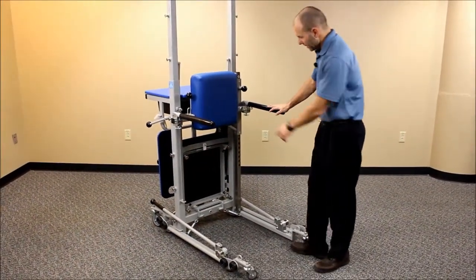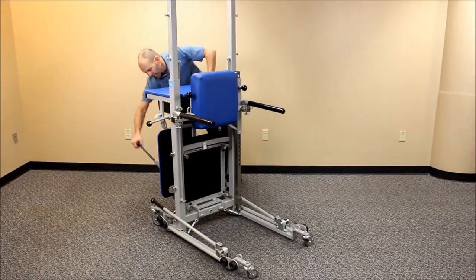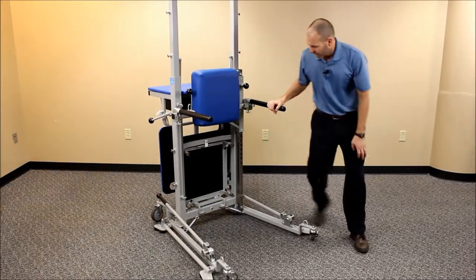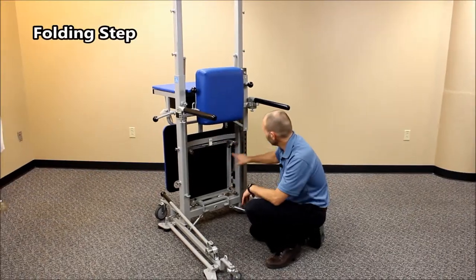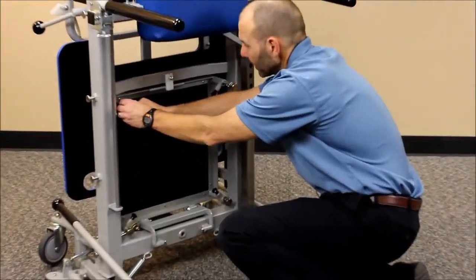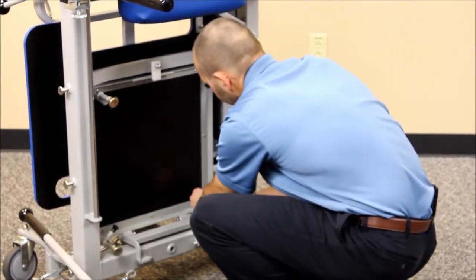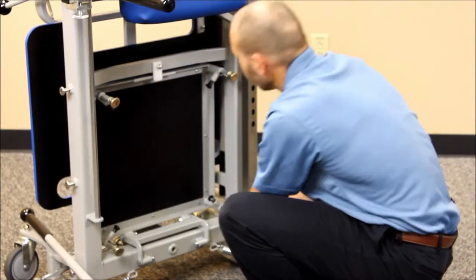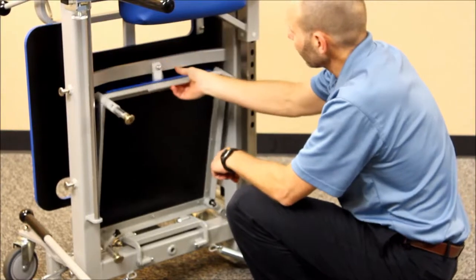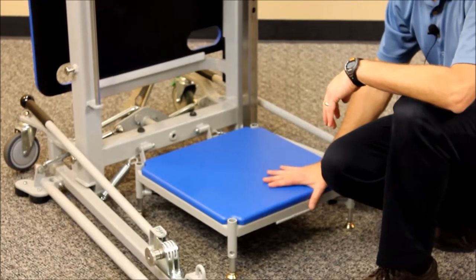On this side of the unit there is an actual step — I'll go ahead and lower the stabilizing bars and lock this into position before showing you. The step is folded up inside the unit and is adjustable. You adjust it by pulling out the black knobs and adjusting in two-inch increments, anywhere from four to eight inches. We're currently in the six-inch position. Move the plastic lock out of the way and this step just drops down — it has a double hinge and lowers into place.